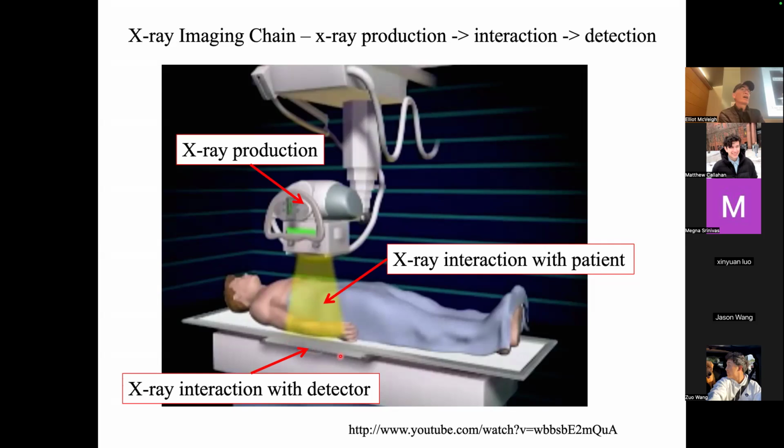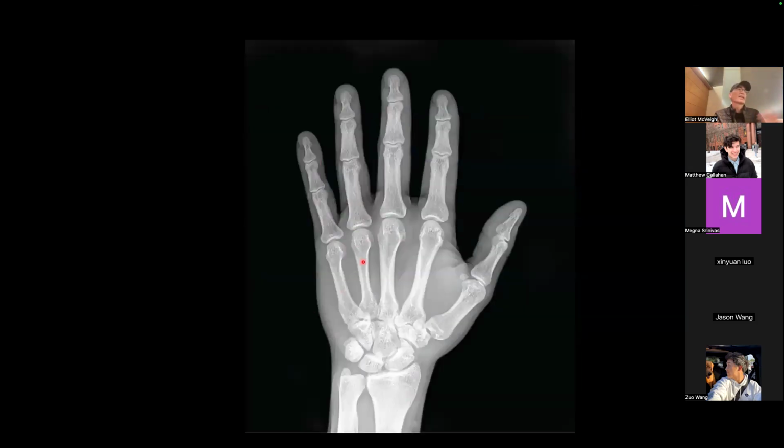This can be a phosphor screen that shines a light when the X-ray hits it, or it can be a direct X-ray cadmium telluride detector that has a shower of electrons come out when an X-ray hits that target. It's just to have some way to detect X-rays that are getting through. And the contrast is generated by the fact that there are pathways that X-rays don't get through. So here, if we look at this bone, a lot of the X-rays coming down through that bone got absorbed by the bone, and so we didn't get a lot of X-rays hitting our target.